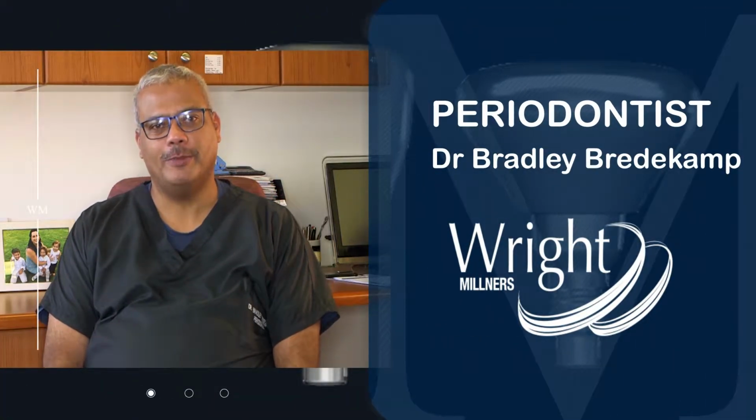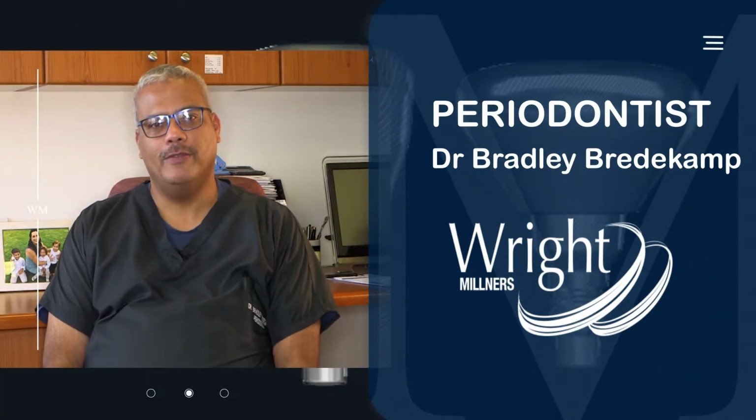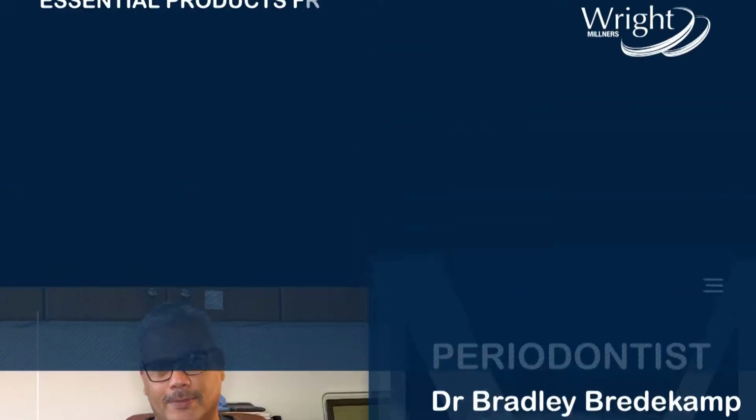I'm a periodontist practicing out of Durban, and today we're going to show you a brief video on the placement of the Megagen Anyridge implant system.